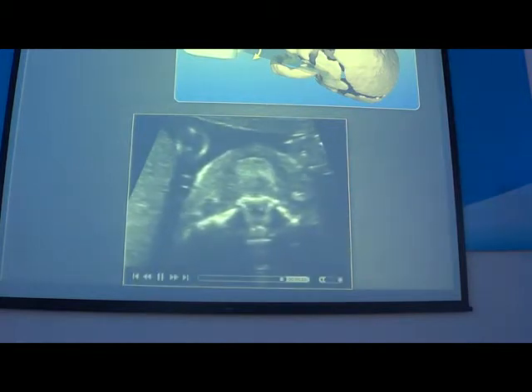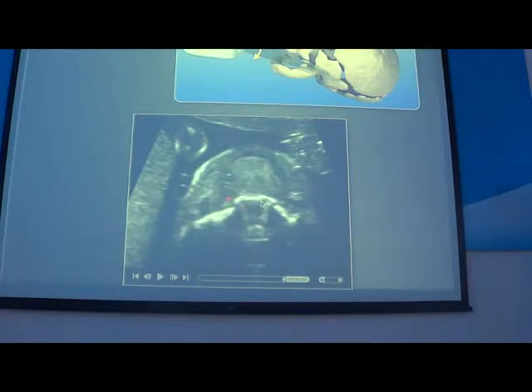And here you can see the posterior border of the palate. And we will see the hard palate. So with this method it's quite easy, and if one day we have to look at the palate on a screening examination, we will do it on 2D.